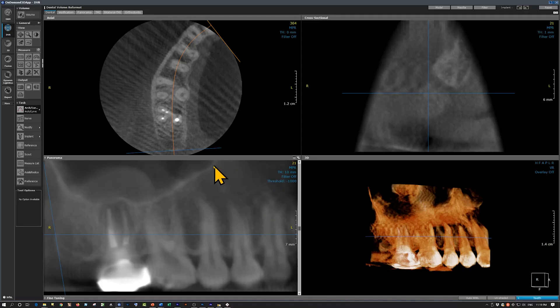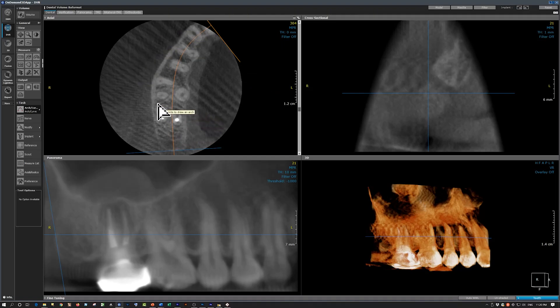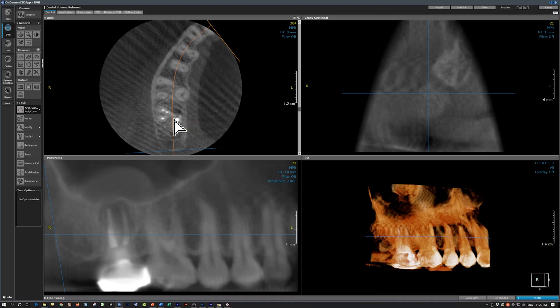This is our CBCT scan. This limited field of view CBCT scan has included the areas of the canine and the third molar. On the axial view, these stripes are image artifacts. This is the second molar. You can see that the mesial root has two canals and both are obturated.